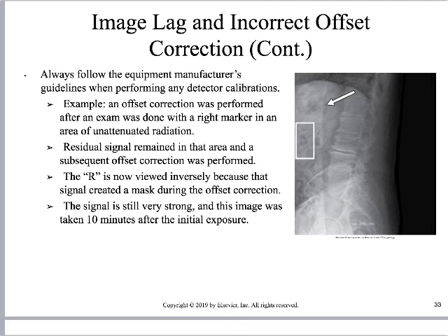So I thought this was a very interesting thing. And she says this signal is still very strong, and this image was taken 10 minutes after the initial exposure. That's how long this lasted because of this human error.